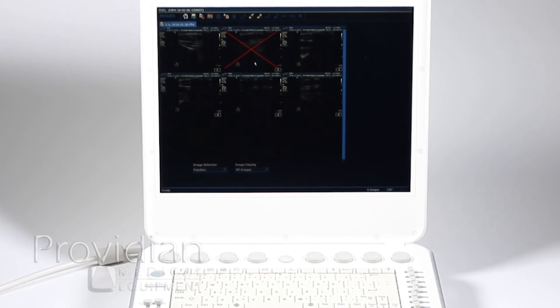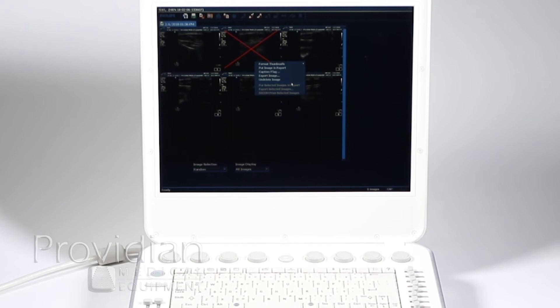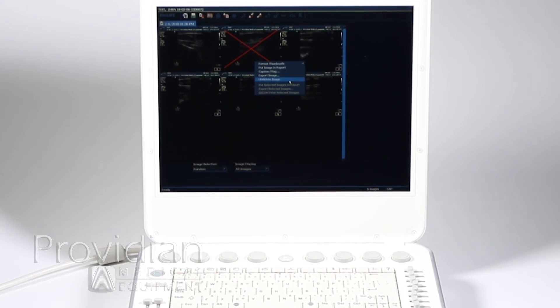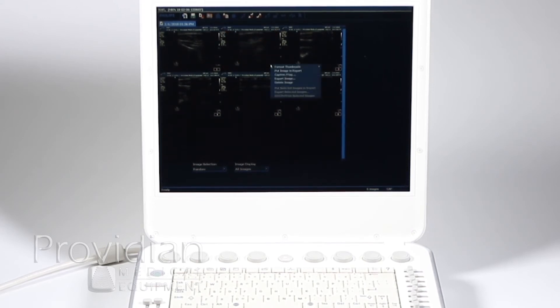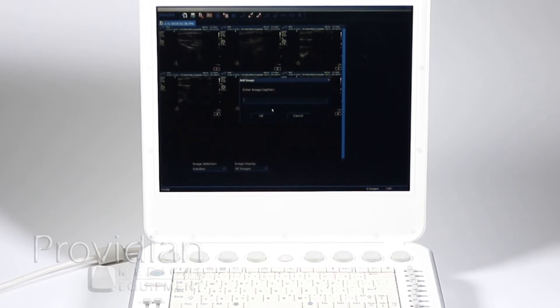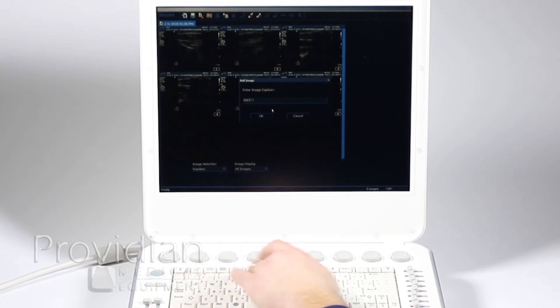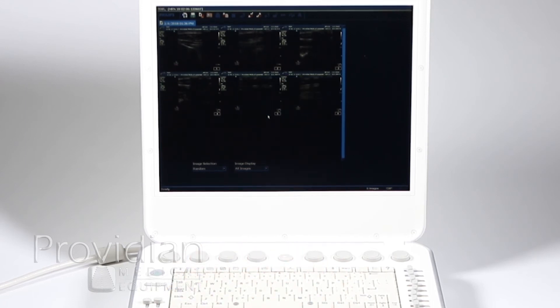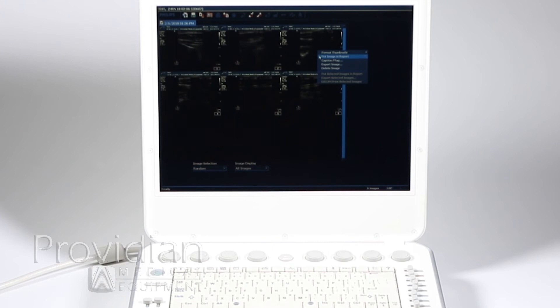I can go ahead and delete the image, undelete the image, I can export that image—we'll get to exporting later—I can add a caption, flag it, or add it to the report. So let's go ahead and add that image in the report. And I can add a caption there, I'll just put that on there, put another image on there.